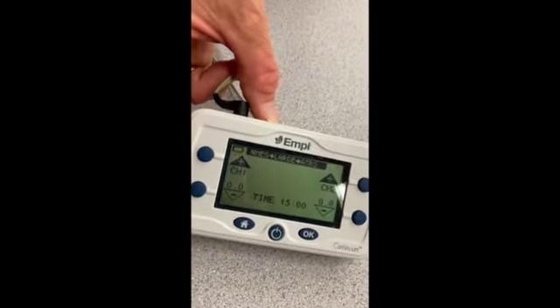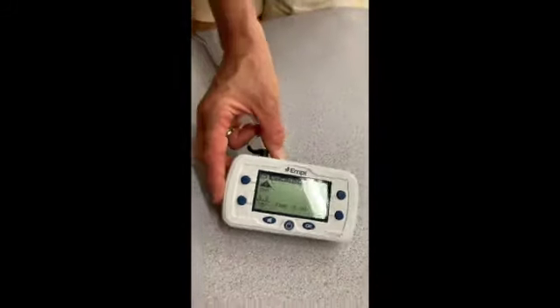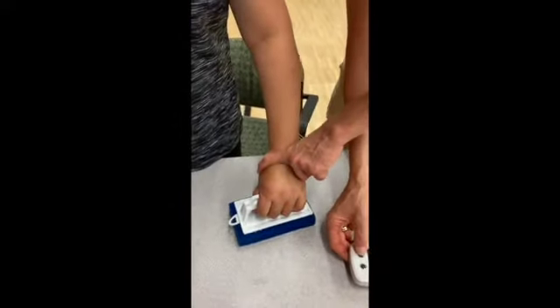In this video, we will use the MPI device. Make sure the electrodes are connected to channel 1 on the left side.